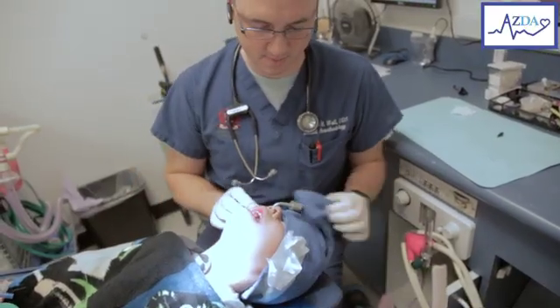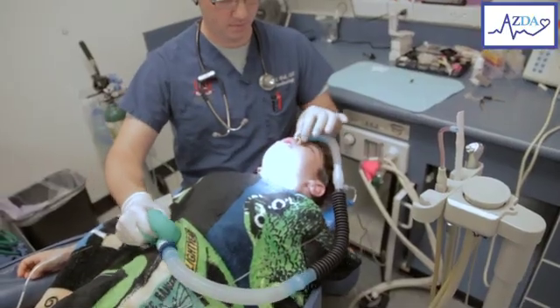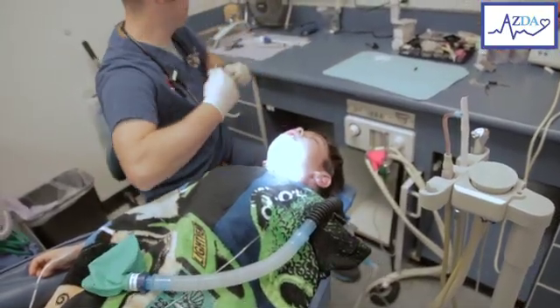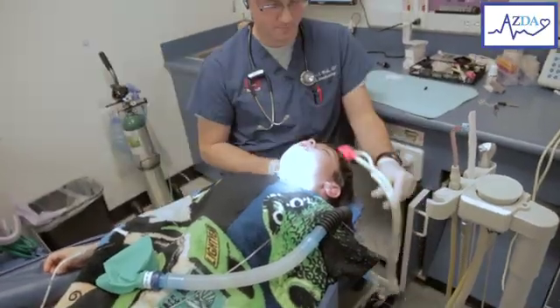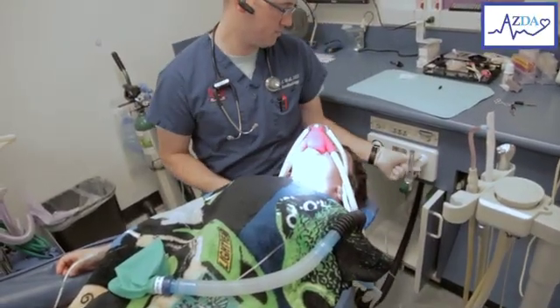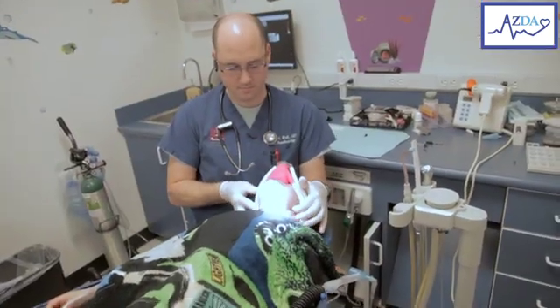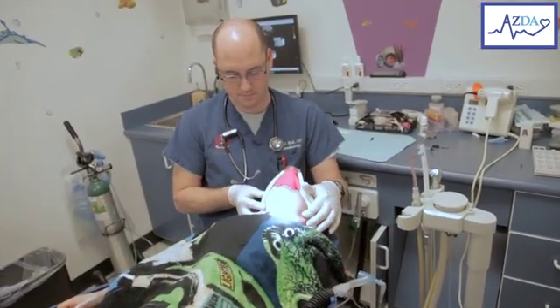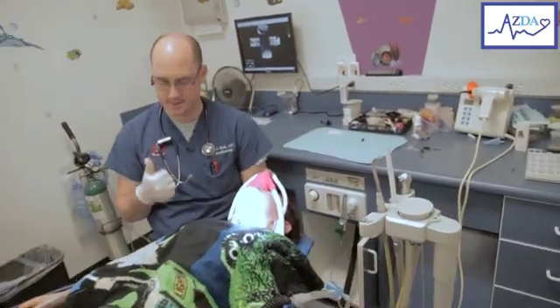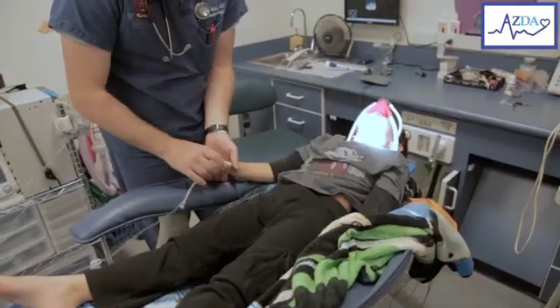Prior to extubation, everything is taken off the patient's face. Dr. Wall gives the patient a breath of oxygen and then extubates the patient. Before the IV is removed, the patient will be stimulated to test for pain reflex. If the patient is responding nicely, they can be transferred to the recovery room, where the IV can also be removed.